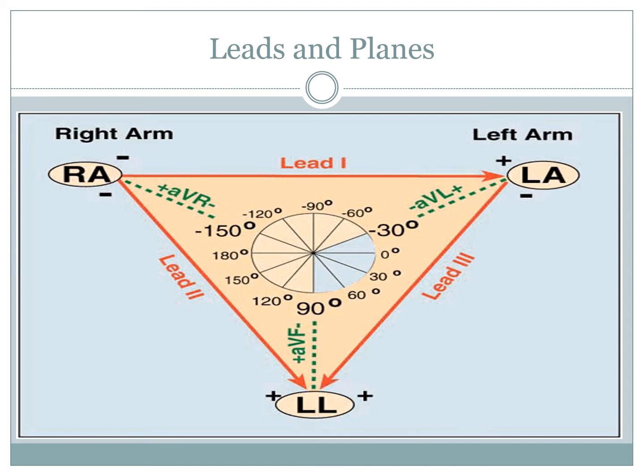Makes sense. The other 6 obviously look at the forces of depolarization for what's known as the horizontal plane. So your precordial leads look at the horizontal plane, and your limb leads look at what's known as the frontal plane. Okay, and that's what we're going to focus on when we look at axis deviation. It is just the frontal plane.